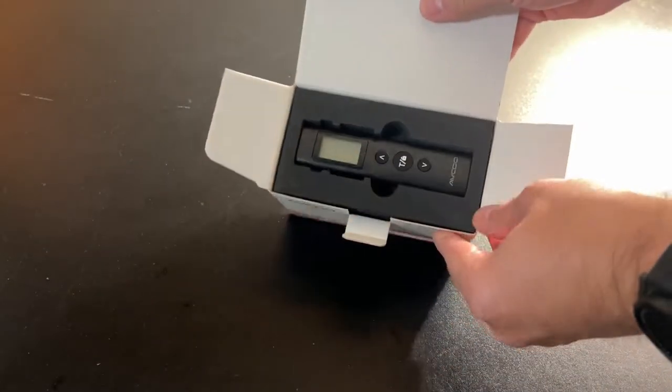Let's open this up and take a look. Okay, plastic's off. Open the box here, and right on top you can see the small, very small size. I like this size — very, very nice.